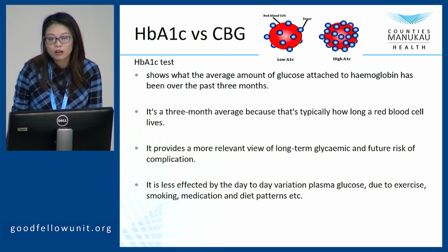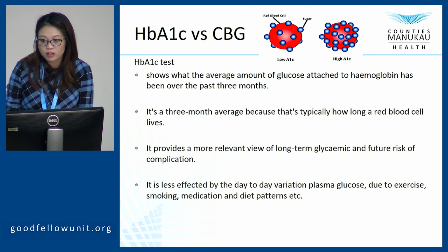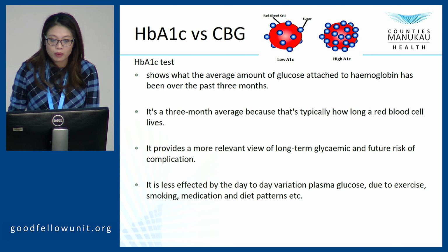So my topic is about target therapy, glucometers. Now we talk about why it's important to test the capillary blood glucose, HbA1c, glucometers, and continuous glucose monitors, and how to utilize the glucometers and when to test the capillary blood glucose.